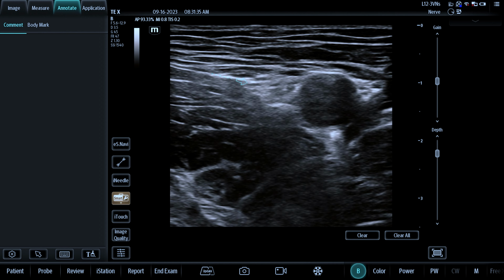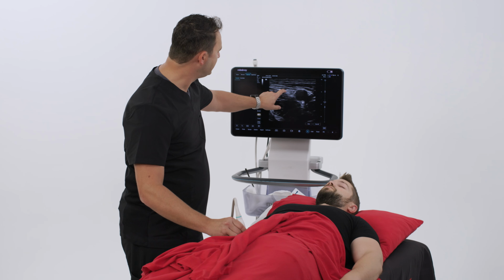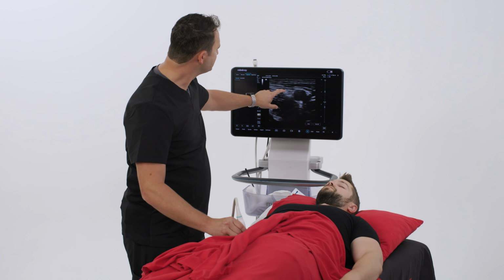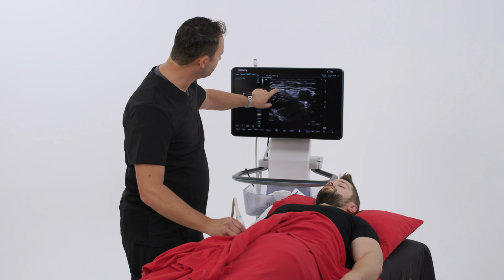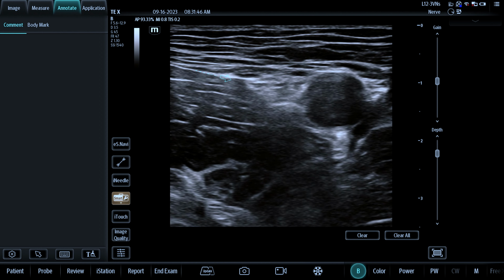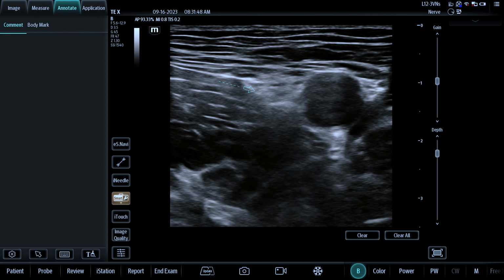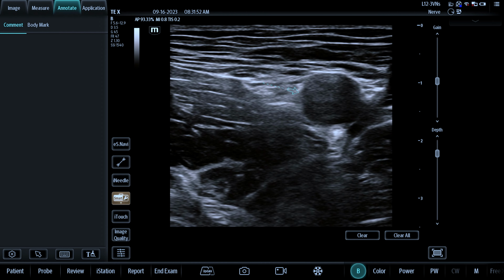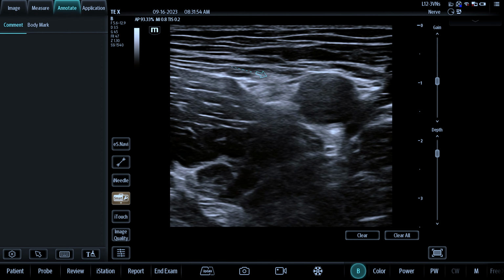And it can also be challenging piercing through the fascia iliaca into the femoral nerve, because you can also damage the femoral nerve. So it's ideal to try to pierce through the fascia iliaca to the lateral aspect of the femoral nerve, come underneath it, and then start your local infiltration, seeing local anesthetic going all the way around the femoral nerve.